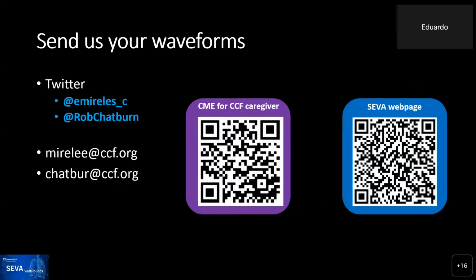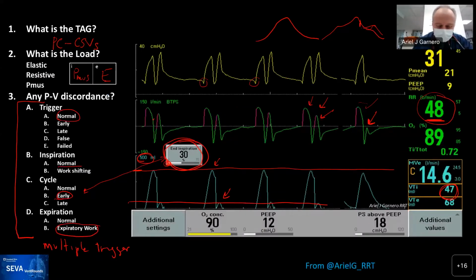Eduardo, if I remember very well, this patient first initiated the inspiration with the diaphragm and right after followed with the upper chest. Yeah, that's likely this type of neuromechanical uncoupling and dyssynchrony of the respiratory muscles that occurs in patients that have these very high elastic loads, because the muscle that is strongest and the dynamics of the chest wall may be affected. So you may see that type of dyssynchrony in how they activate the muscles.